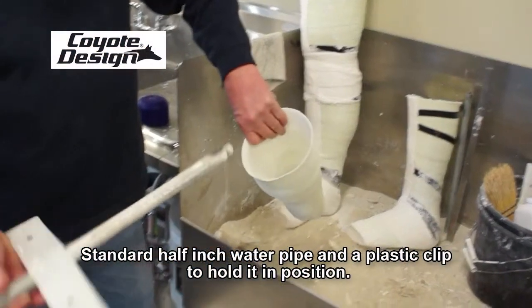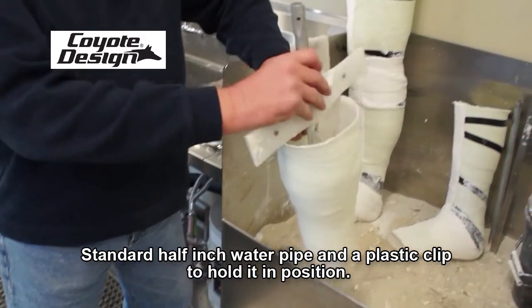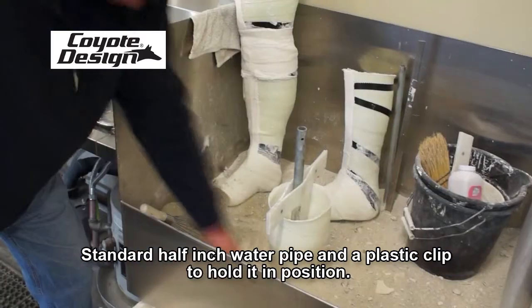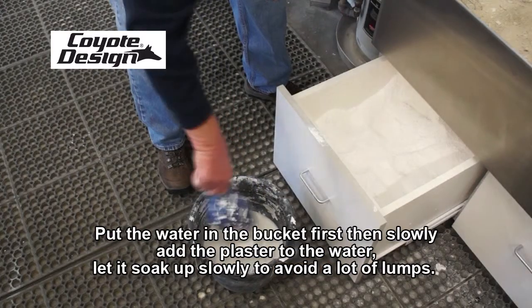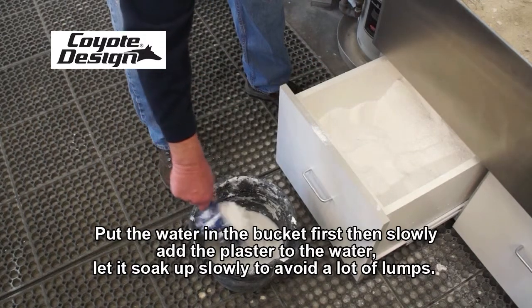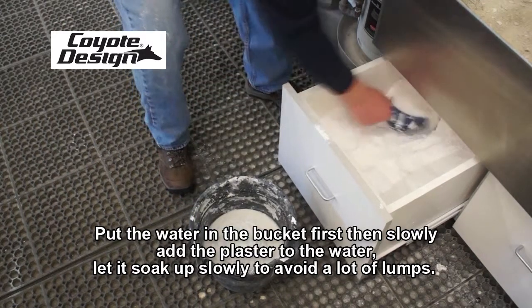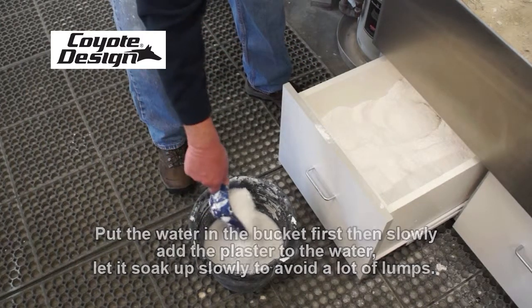We have our model in place with a standard half-inch water pipe and a plastic clip just to hold it in position. We set that up in our cast box, and we basically recommend that you put the water in the bucket first and then slowly add the plaster to the water, letting it soak up slowly to avoid a lot of lumps.